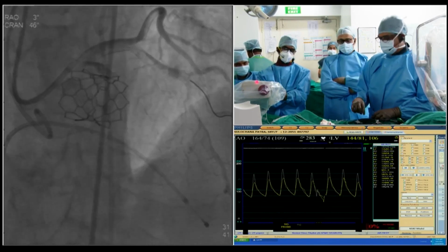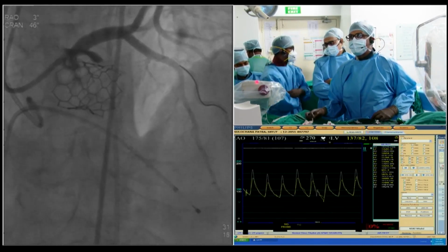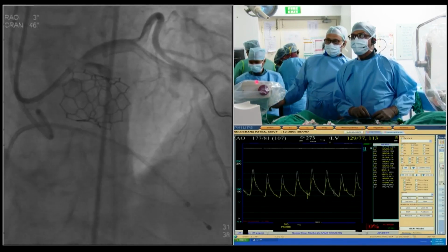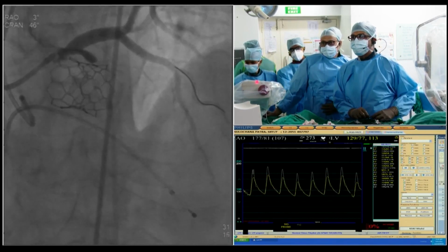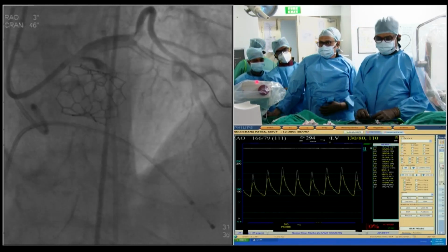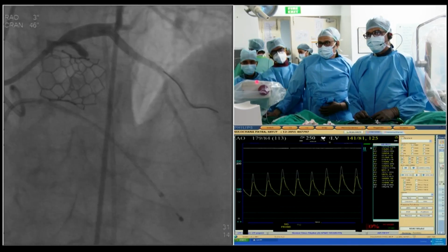I don't think that. Okay, okay. I think it's still a great job done. And our minds have been open to all the possibilities and the step-by-step approach to handling low coronary ostial height in a small annulus, and why you chose a balloon expandable stent valve.